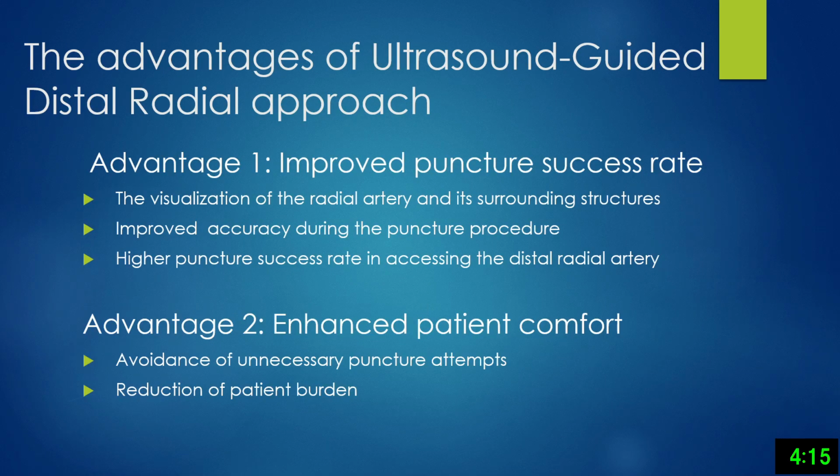Finally, I would like to discuss the advantages of ultrasound-guided distal radial approach. Ultrasound guidance leads to enhanced accuracy during puncture procedure and increased success rate in accessing the distal radial artery. Using ultrasound guidance may potentially enable a novice operator to achieve a similar puncture success rate as an expert.